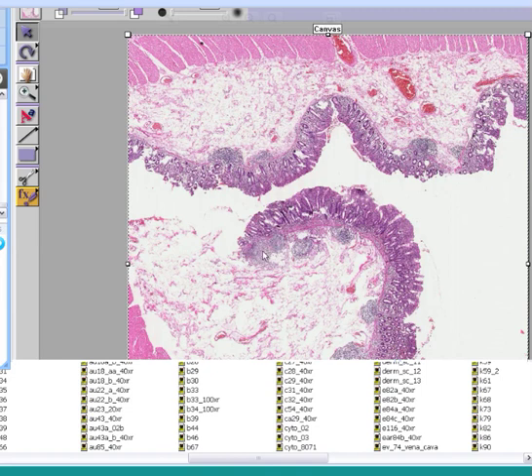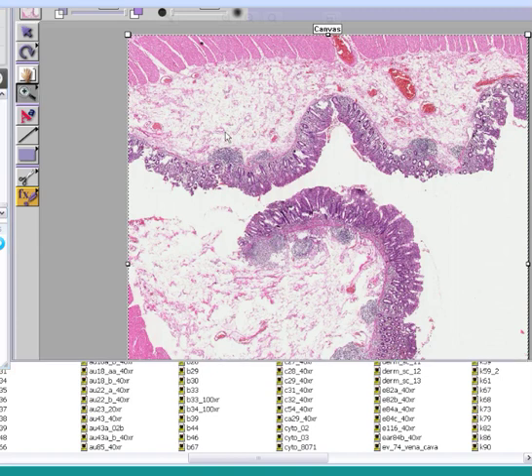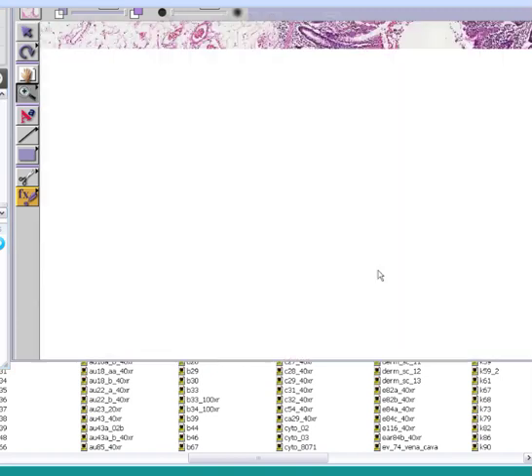And if they were simply just patches of lymphocytes, you could call them a primary follicle. And if you thought you saw a germinal center, you could call them a secondary follicle. So at this point, I think you're thinking, if there's any disease here at all, the muscle looks great, the submucosa looks great. So let's look at the mucosa and see what we want to say.